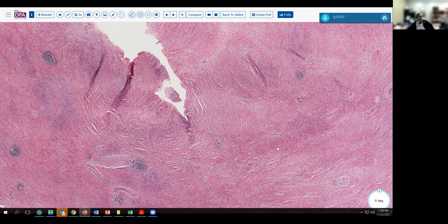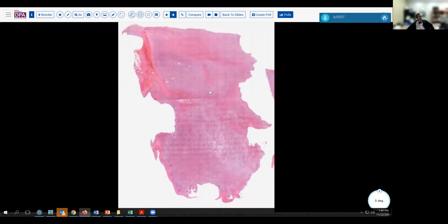So if you need to do molecular analysis to differentiate whether you have a CTNNB1 mutation or a FUS-CREB fusion, whatever, then that should be done because the management of these two tumors would be quite different. We'll take another example of this tumor.